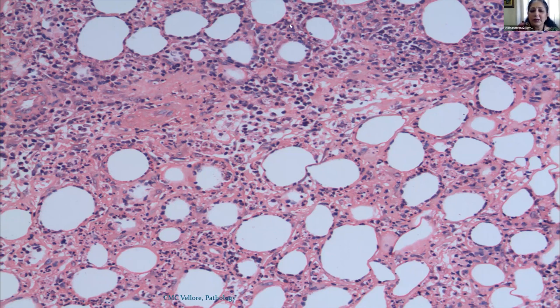Okay. What infiltrate is it? LHEN. Easiest way to think: lymphocytes and histiocytes. Okay. So there are a lot of lymphocytes because they've got blue nuclei.